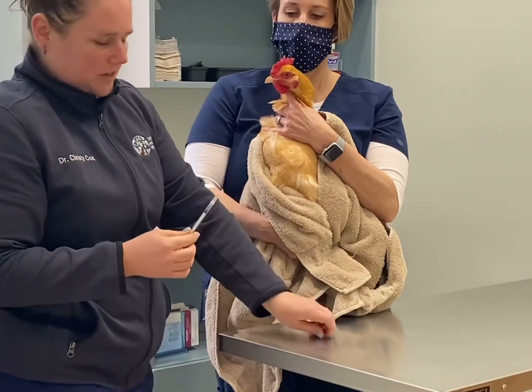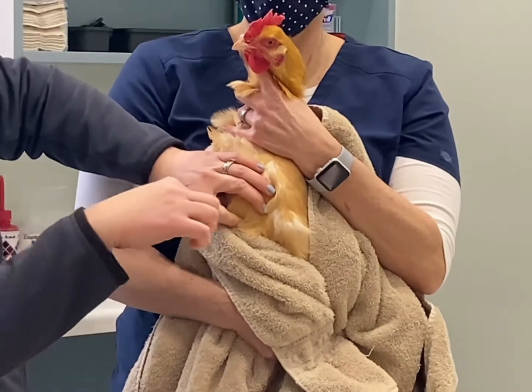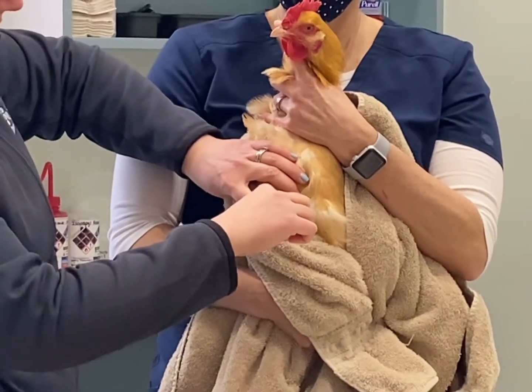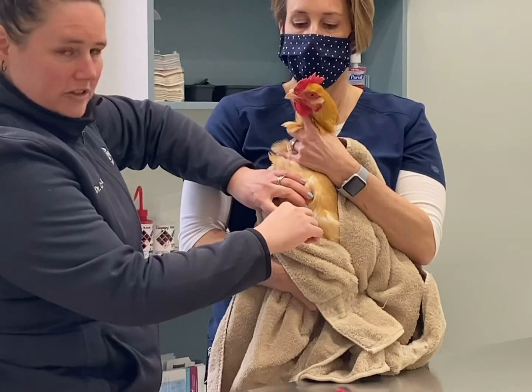Just uncap your needle, put your finger on the keel bone, feel the muscle there, and you're going to inject perpendicular into the chicken. Just go in a little bit. If you hit the keel bone, that's okay — just back out a little bit. You want to pull the syringe back a little bit to make sure you're not getting blood.